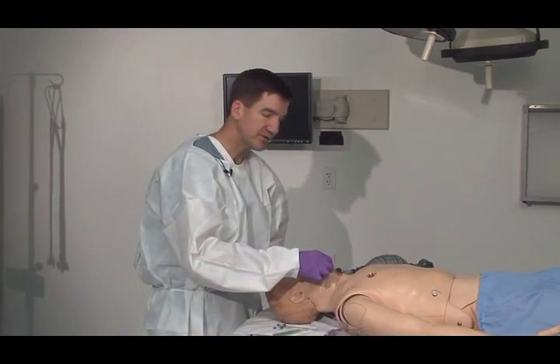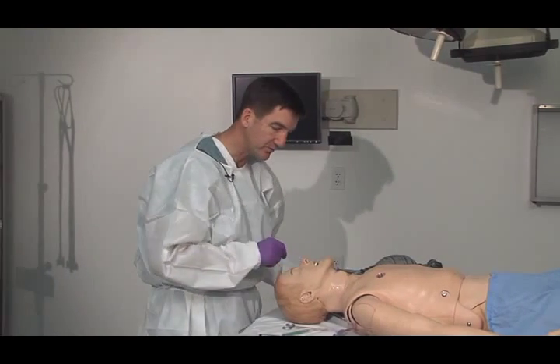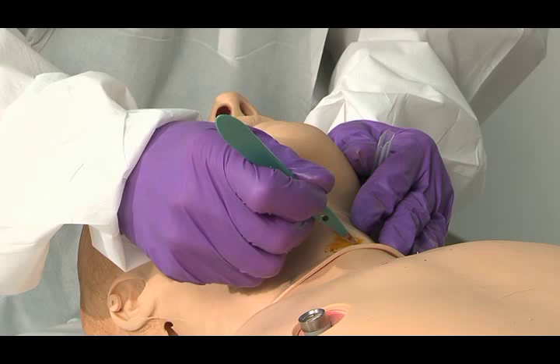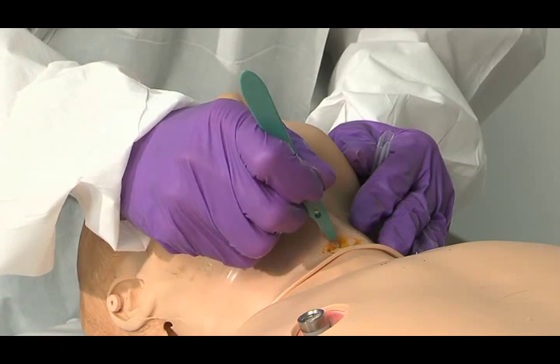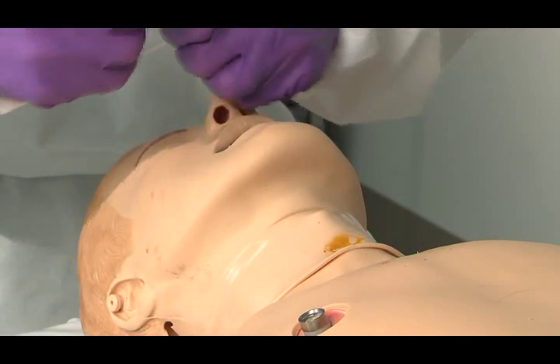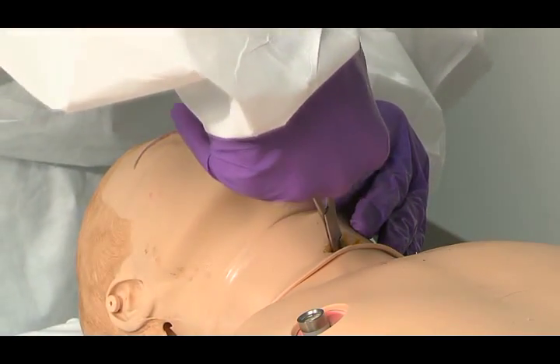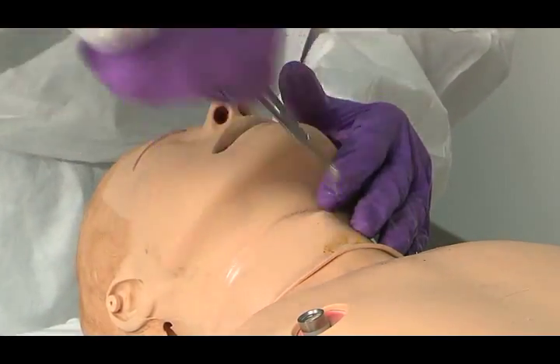You'd want to clean the area with your antiseptic — Betadine is a great choice of course. The incision is horizontal, right across, relatively superficial. You can widen it a little with blunt dissection using your forceps.